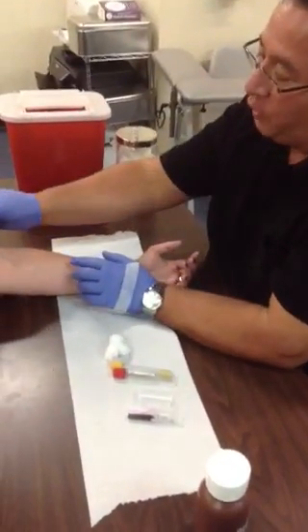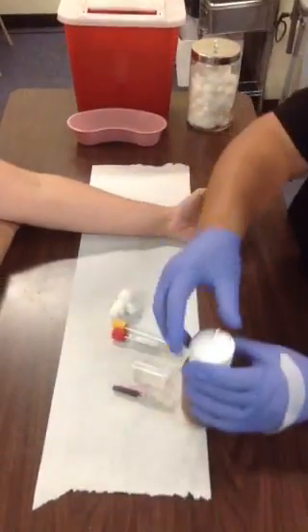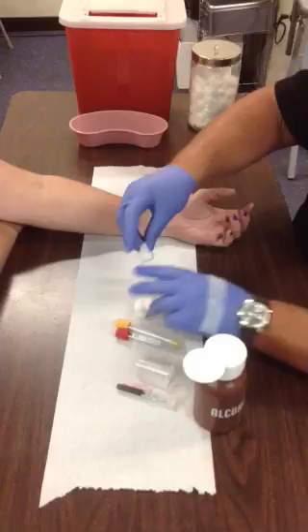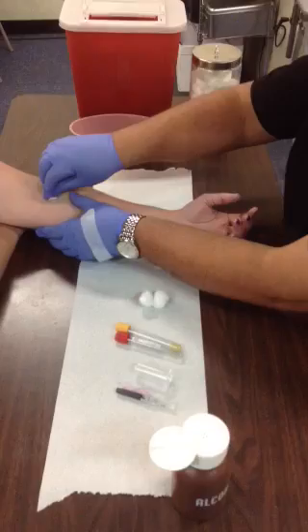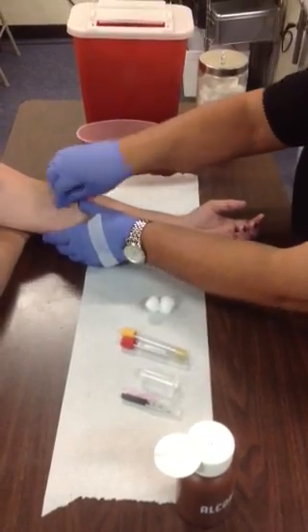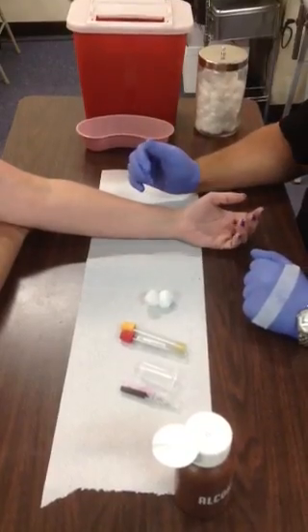Remember to landmark it so you remember where to go, because after you prep it with alcohol you can't touch it again. Take your cotton ball and prep the skin using small to larger circles, apply firm pressure, and clean off all that surface debris. Give that 30 seconds to dry.